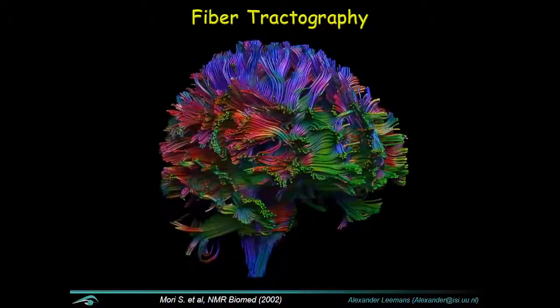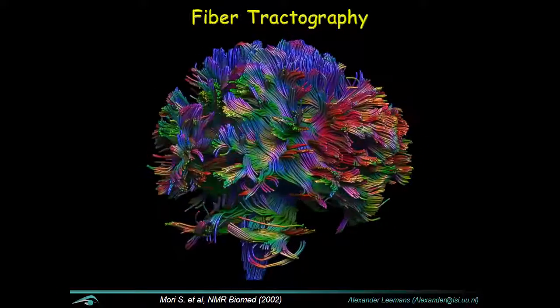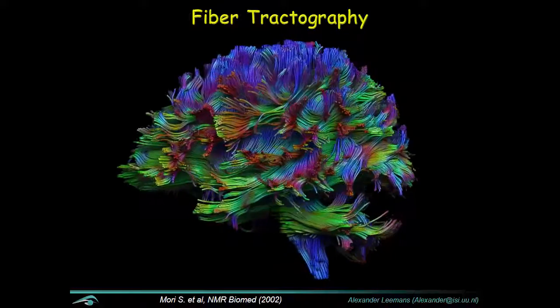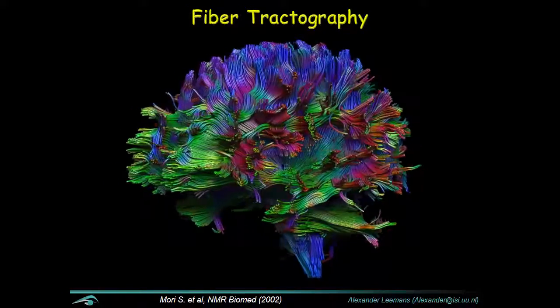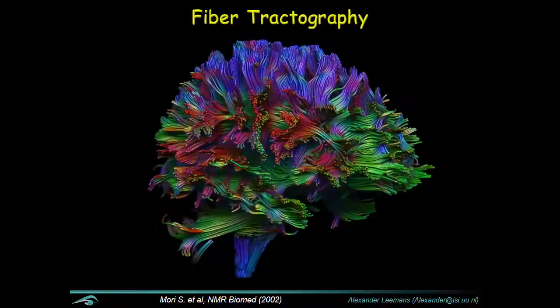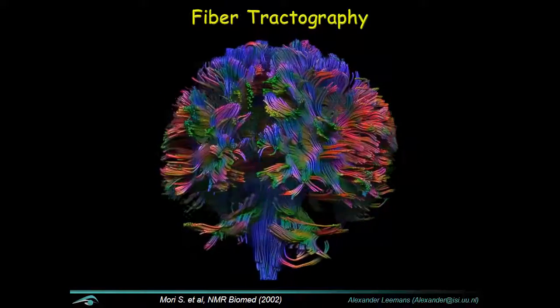And apologies for the lame joke, Chris, but I once had a junior radiologist that came up to me and said like, "Oh, Alex, I didn't know these axons were that thick." Okay, so obviously we're not looking at axons. These are just representations of pathways reconstructed with tractography.